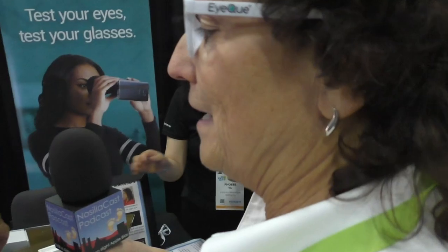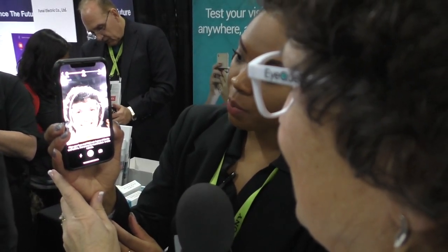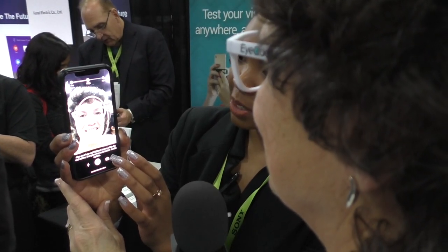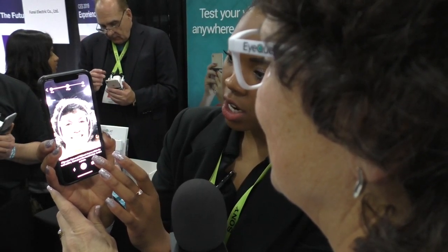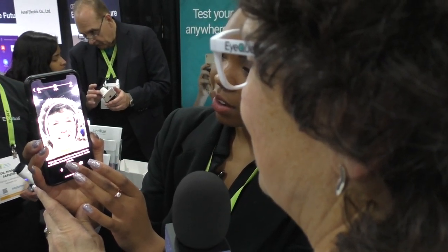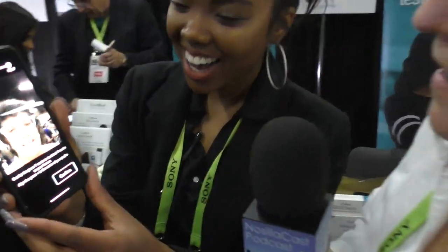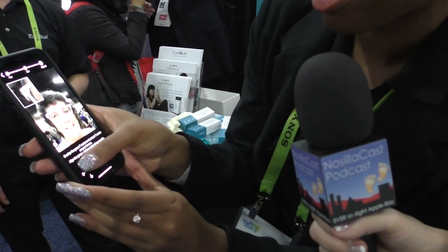You can use either the front-facing or back camera — let's do front-facing so we can do this on me. Get the frame centered in the middle, make sure the frames are fully in frame. One, two, three — okay maybe the frames weren't all in there. There you go — that's nice looking! I've got green crosshairs on my eyes.